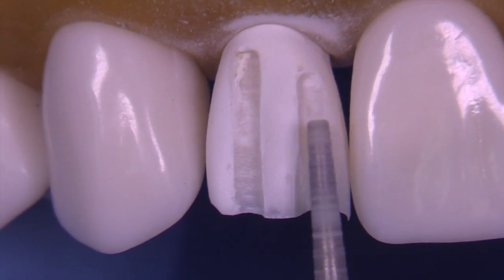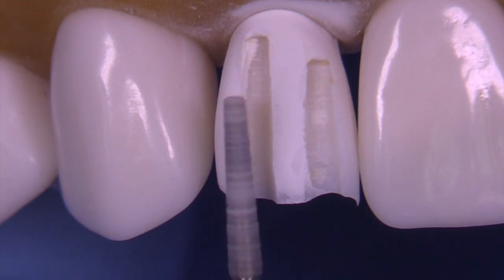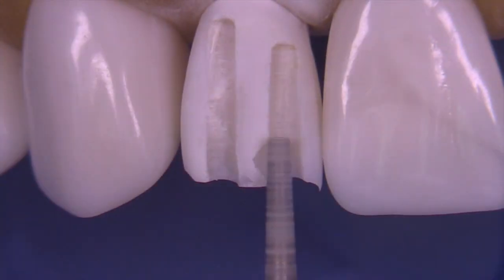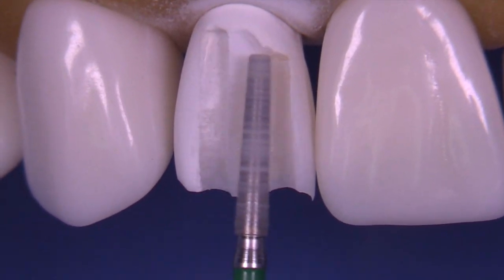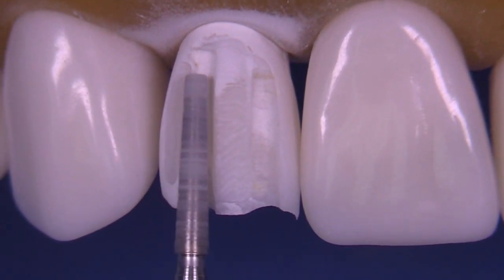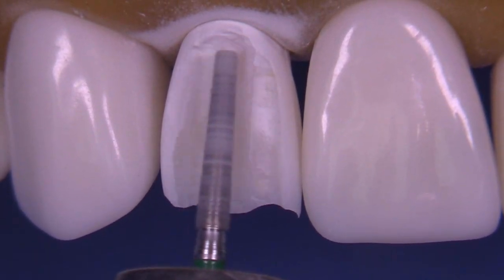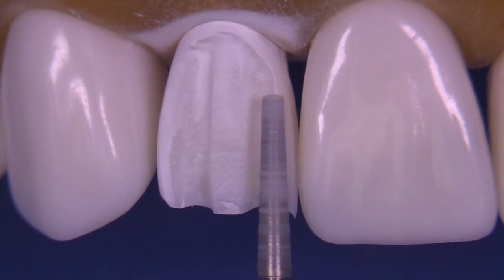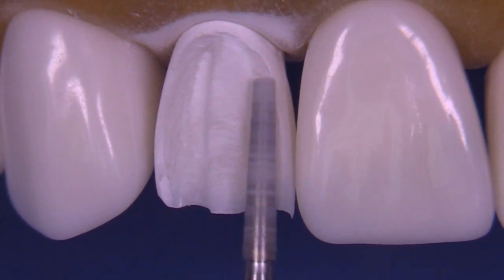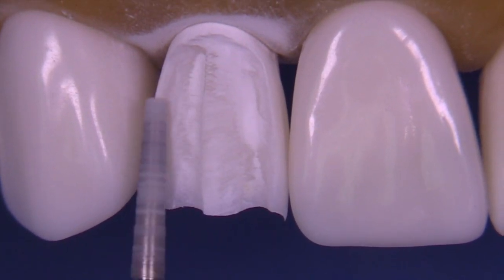I think it's really important that you are conservative at first with your lingual clearance and your incisal reduction so that you have room to play around a little bit with the finishing to get the edge in exactly the right position. As you'll see in this video if you watch to the very end, we do need to make a few modifications in the length at the end after doing all the other steps.